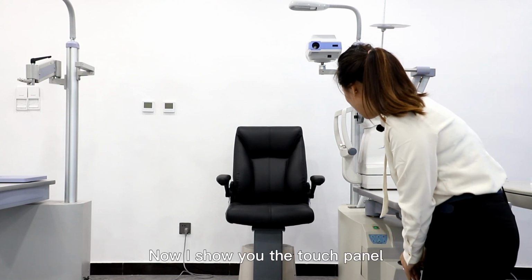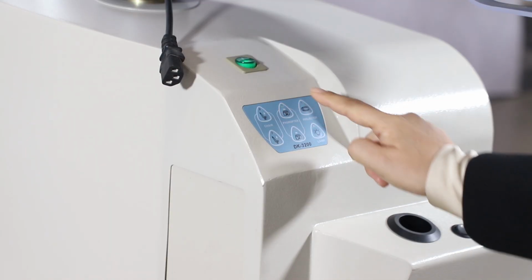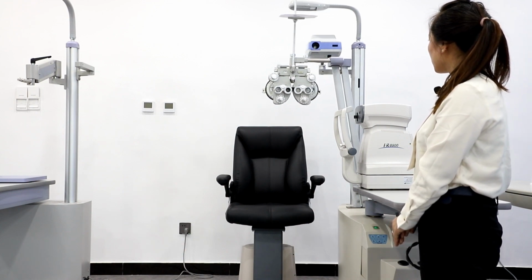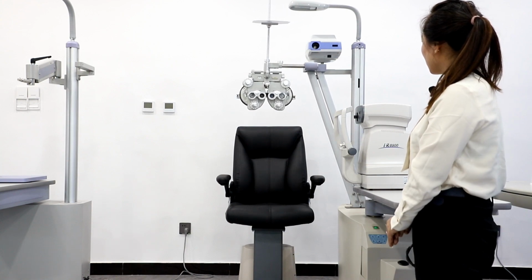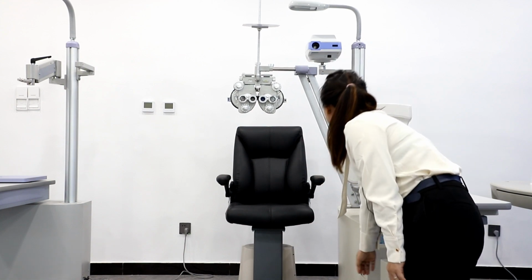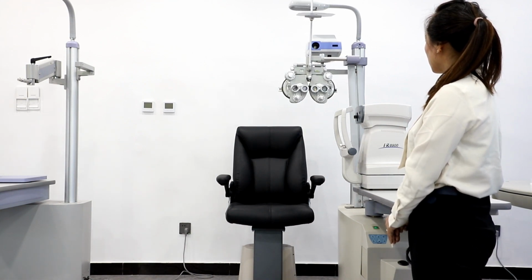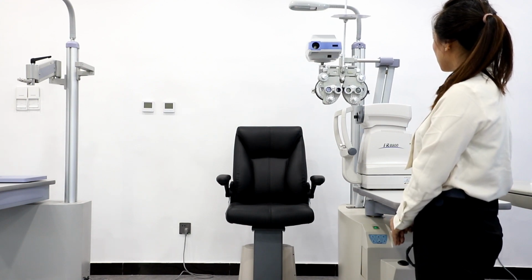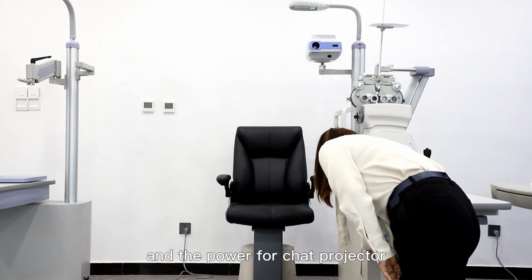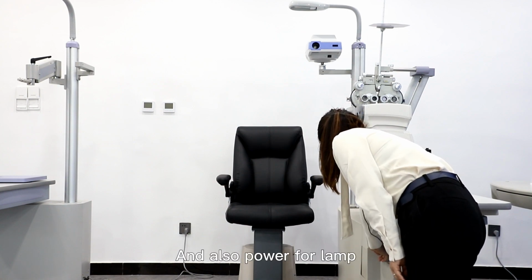Now I show you the touch panel. Adapter on. And the power of the chart projector. And also power for the lamp.